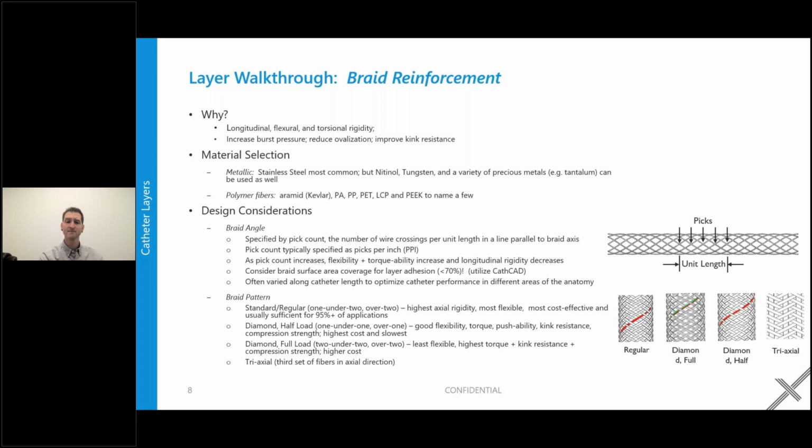But there's some performance benefits to it. You're going to get more flexibility out of the standard pattern, reasonably similar flexibility out of the half load pattern. You're getting some trade-offs here between kink resistance and compression strength. The most commonly used is going to be standard, probably why it's called standard.